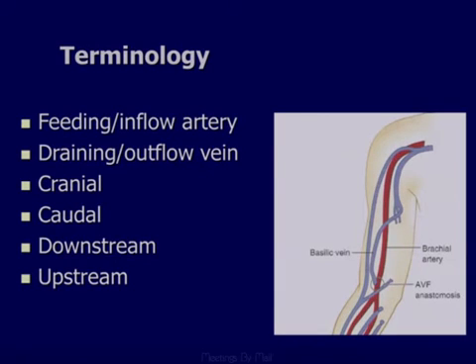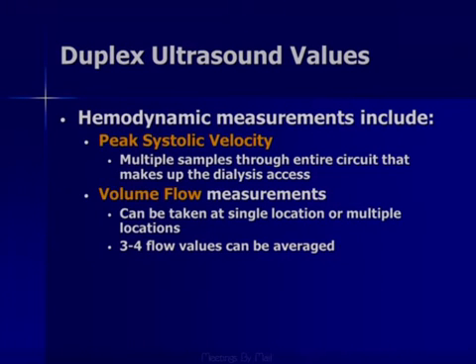Probably the harder thing, I think, is figuring out what do we call it in terms of proximal and distal, because that kind of gets confusing. I've seen some folks use cranial and caudal, or downstream or upstream. I think whatever you use should be documented in your protocols and defined so that somebody can come to the same conclusions if they're picking up your work.